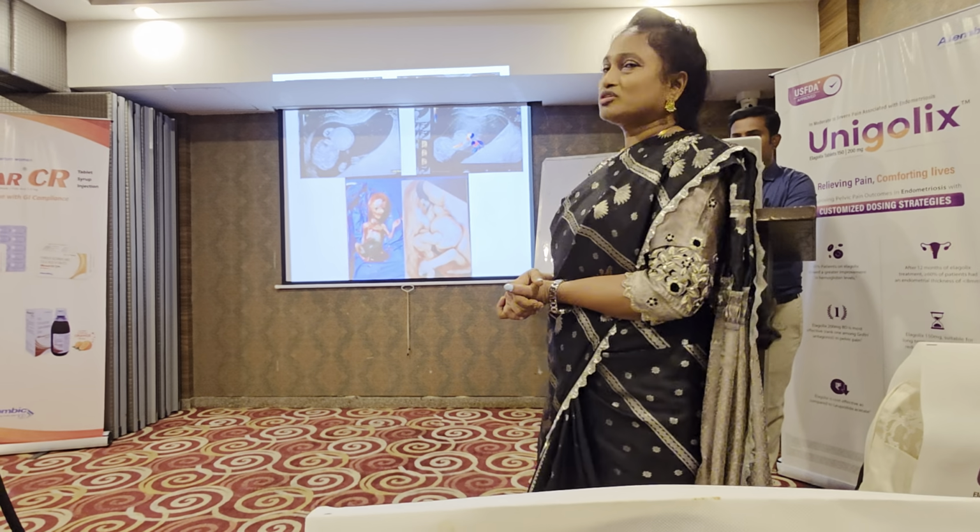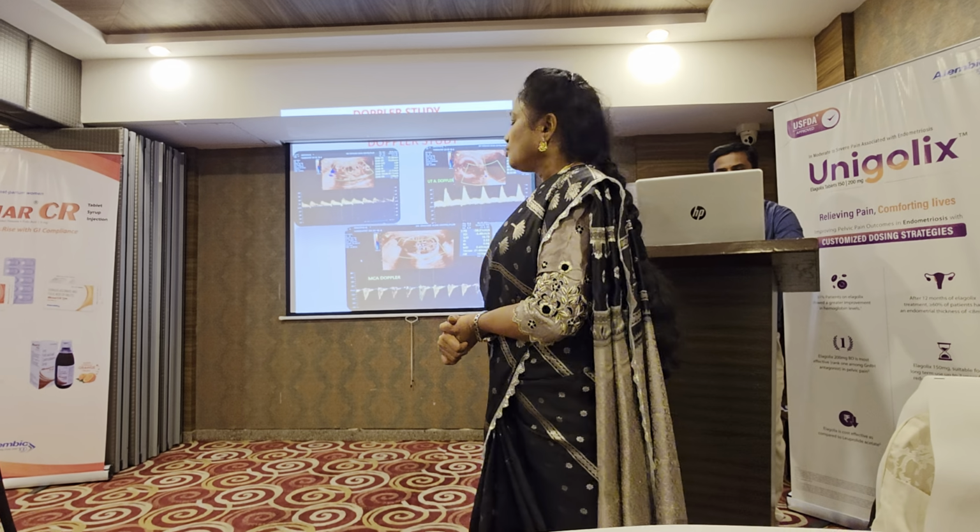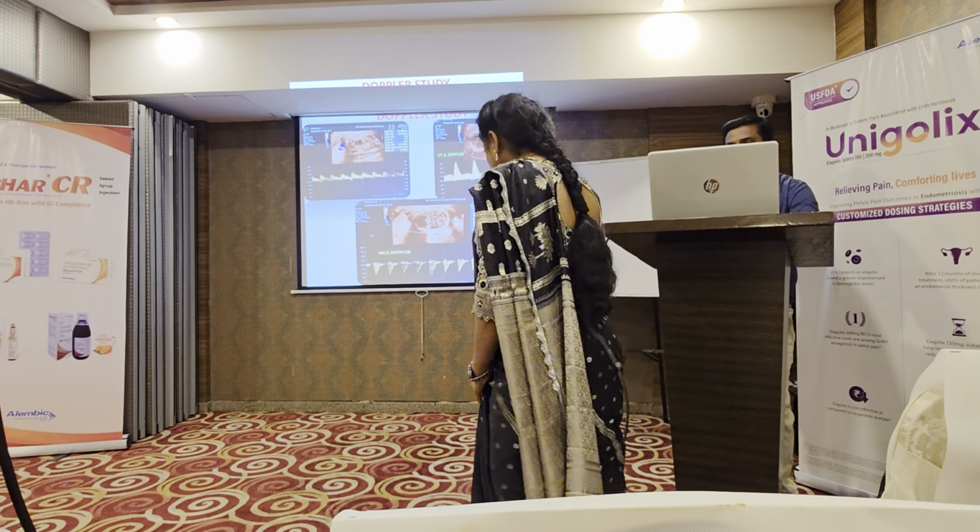In this case, we had to abort the baby because liver was the content. Next one. So Doppler. What are the 3 important Dopplers that we do?